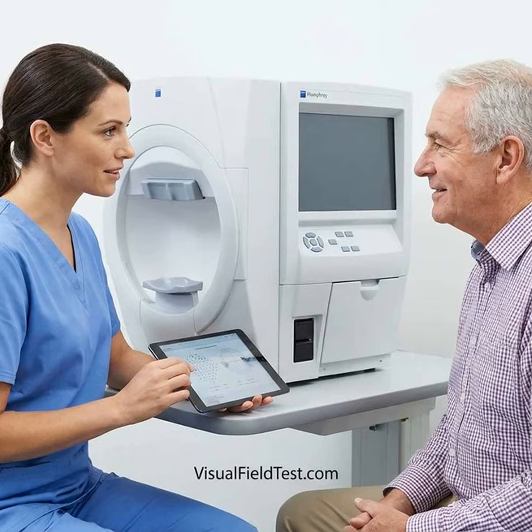In a study of 90 patients, 3 instruction methods were compared: verbal instruction alone, video instruction alone, video followed by verbal instruction. The combined video and verbal approach resulted in the fewest repeat tests. Both video instruction and combined instruction produced more reliable fields than verbal instruction alone.